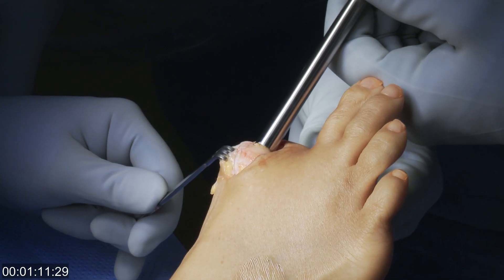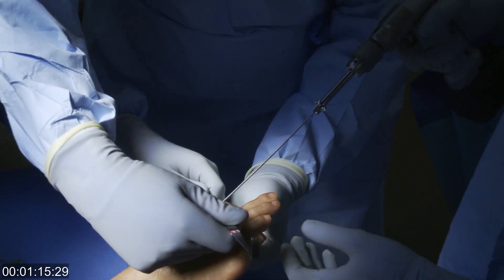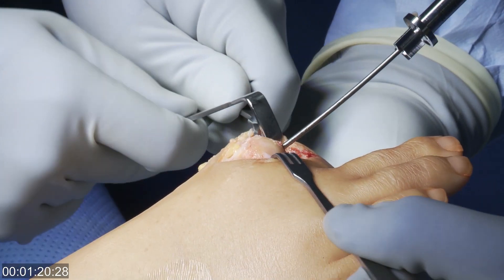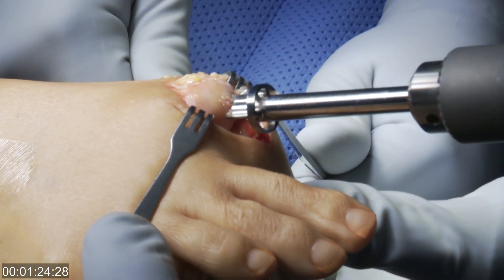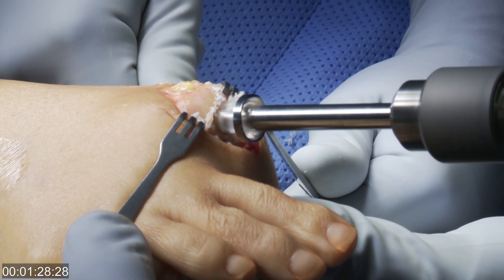We can then use this guide and pin inserter in order to place a central pin in the first metatarsal shaft. This centers the drill for creating the hole in the end of the metatarsal that the implant fits into.